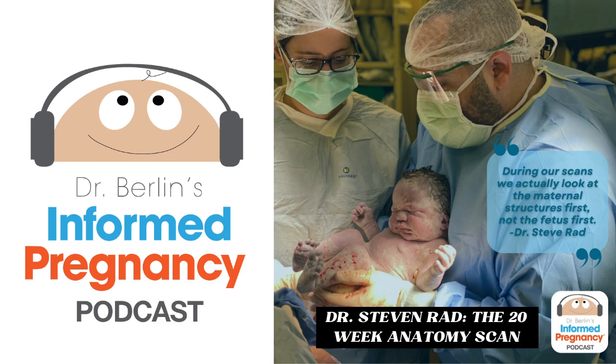It's really what I call a tour of the human body from head to toe, and we look at it very carefully, and we look at each organ carefully. It takes a long time because we want to get the most beautiful images and make sure that it's following the protocol carefully. And we double check things, so we see things at least twice.